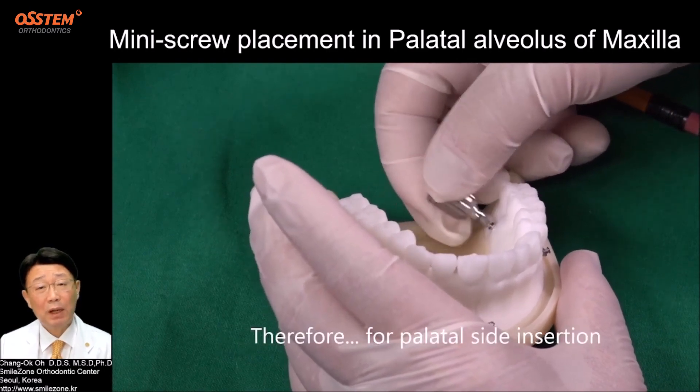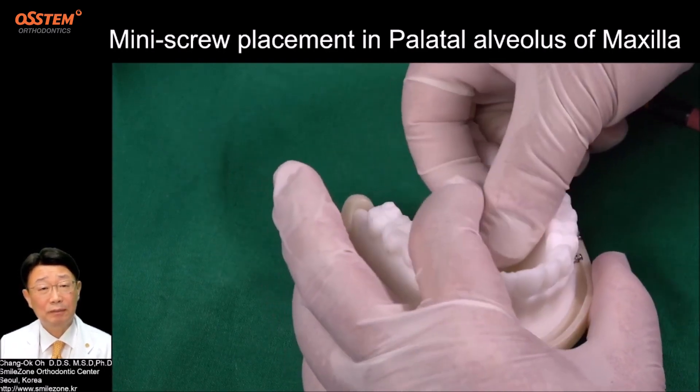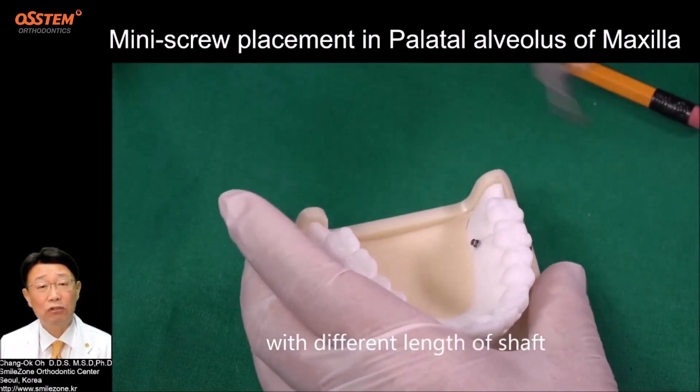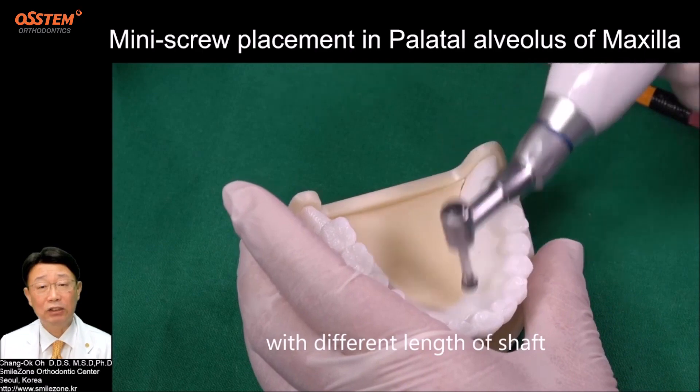Therefore, for palatal site insertion, please use a motor-driven handpiece or e-driver with different lengths of shaft.